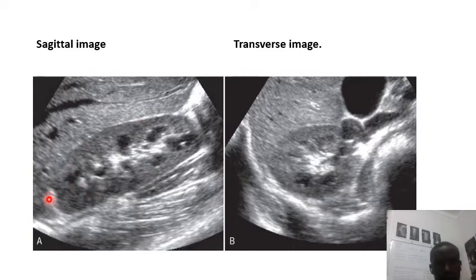Then what you can see here is a beautiful kidney. It has this outermost part, echogenic, which is the renal capsule. Then also we have the renal cortex. Then these hypoechoic areas are the renal medulla. Whereas these hyperechogenic structures, these are the renal sinuses.